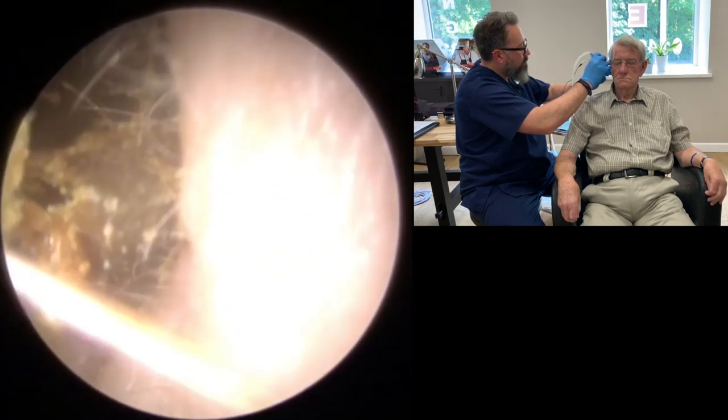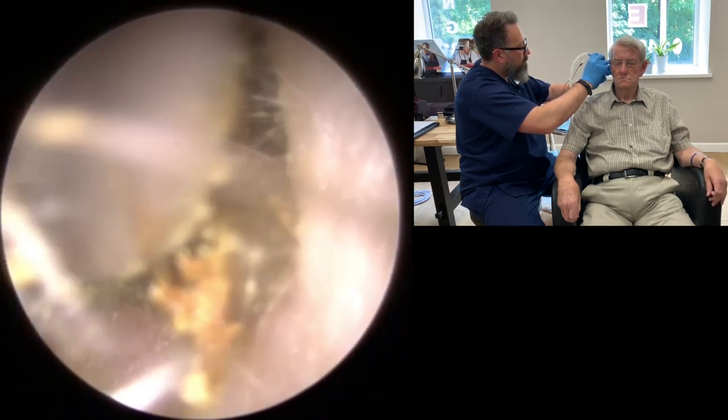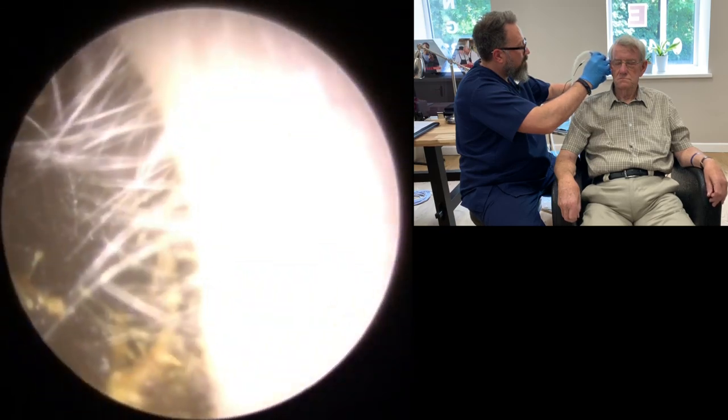Here we are, just wiggling that up and down just to try and free it up from the canal wall. So we've got a really thick and sticky bit now. The other one was breaking down in pieces, whereas this one is staying in one thick sticky piece.